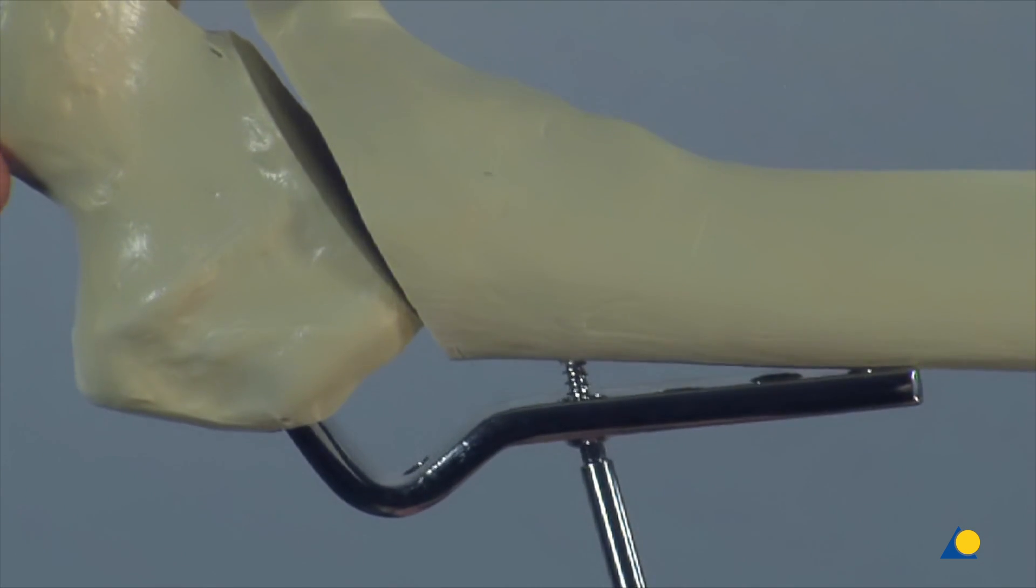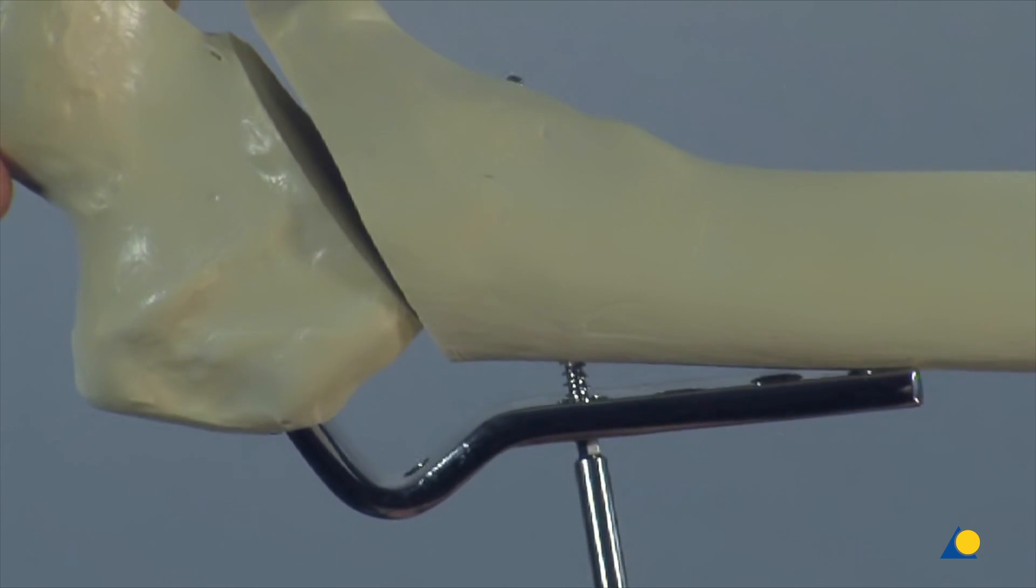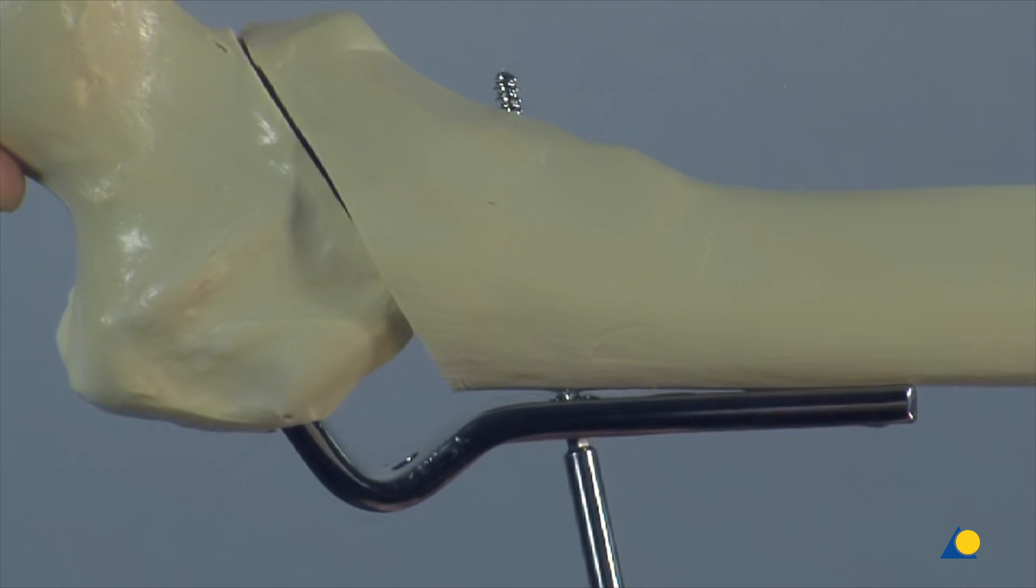The plate is drawn to the bone, leading to closure of the gap and compression across the osteotomy.